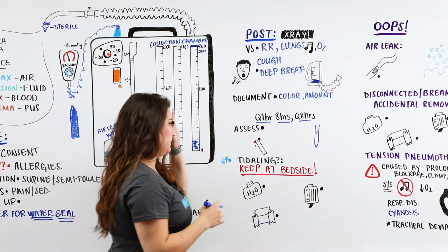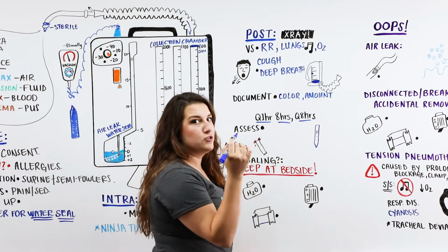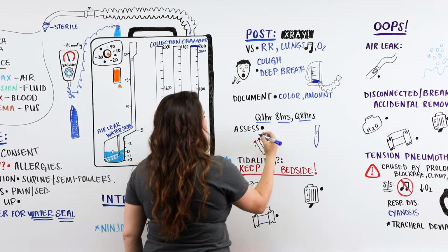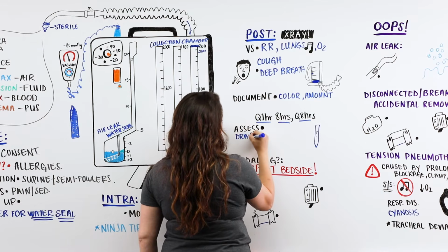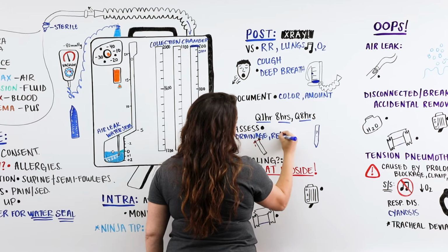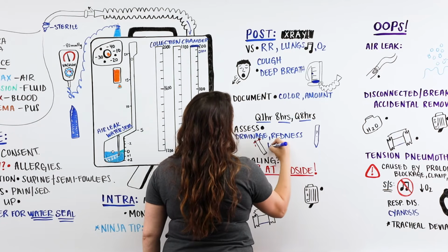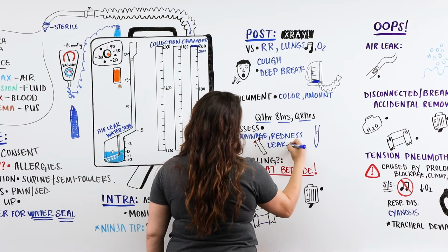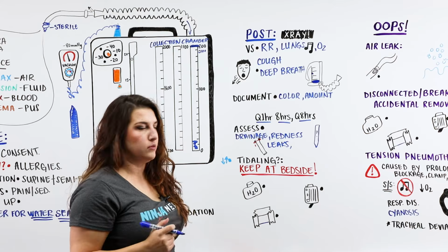or writing it down. You're also going to assess the site. Make sure the site looks good, right? So assessing for any type of drainage, redness, or any type of leaks at the site as well. So you hear sounds or anything that's coming out that shouldn't be.